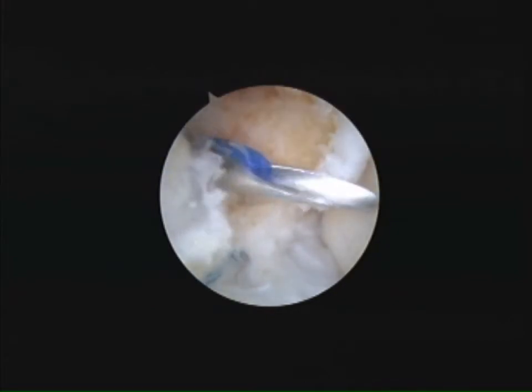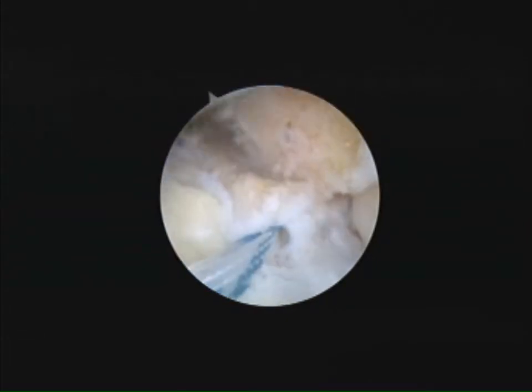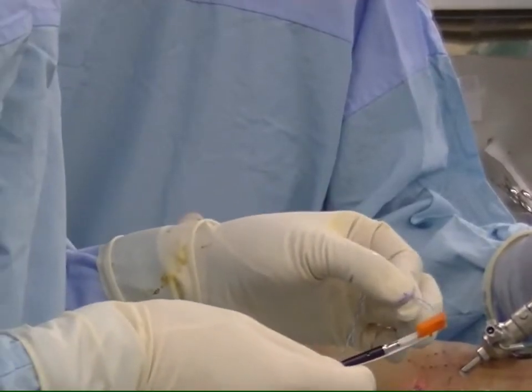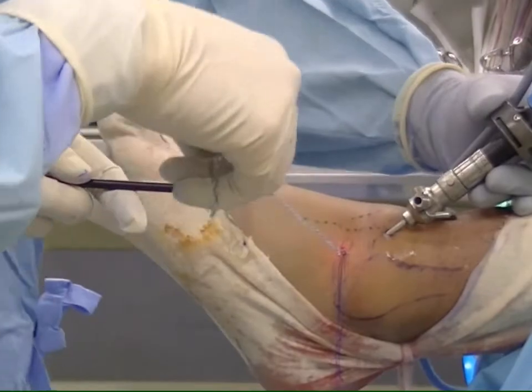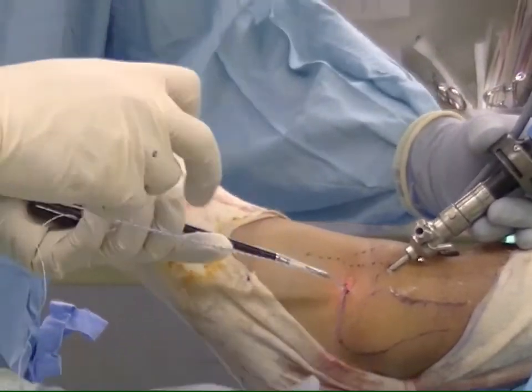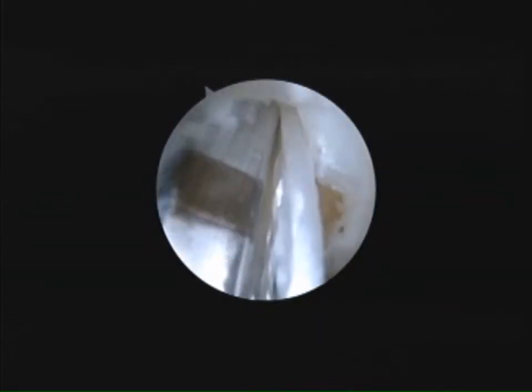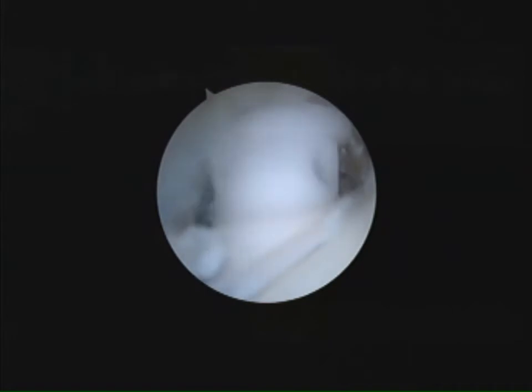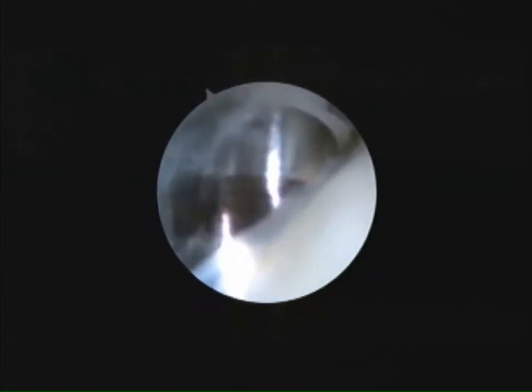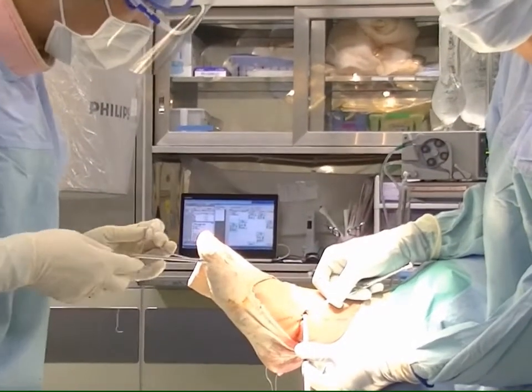An 18-gauge needle with a nylon loop is inserted just in front of the fibular anchor hole from the lateral side, and the nylon loop is picked up from the accessory anterolateral portal. The tape that captures the ligament is inserted into the outlet of the Nautilus anchor with an artificial ligament. Next, this anchor is inserted onto the fibula.